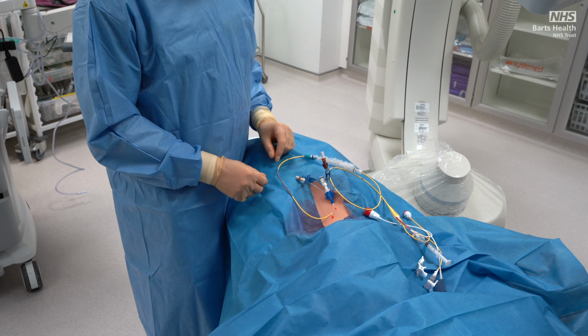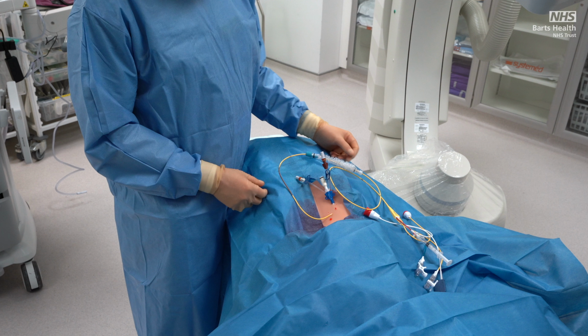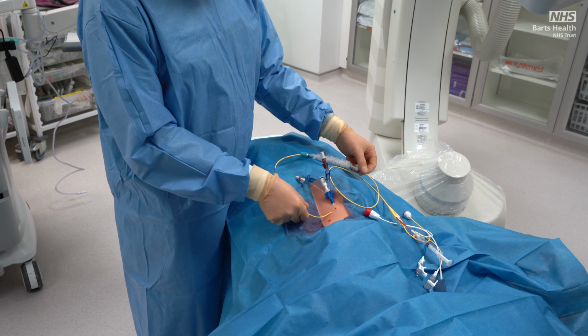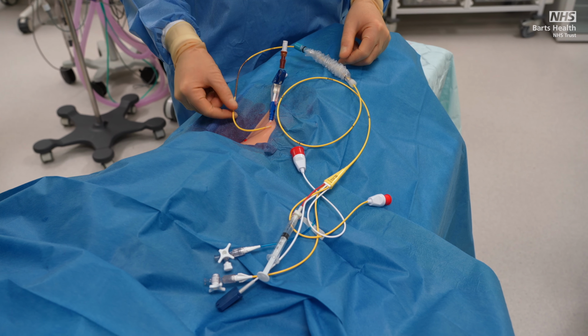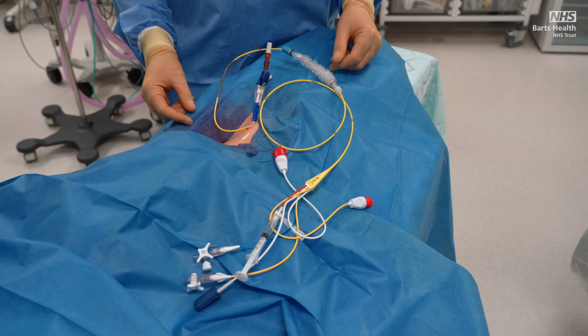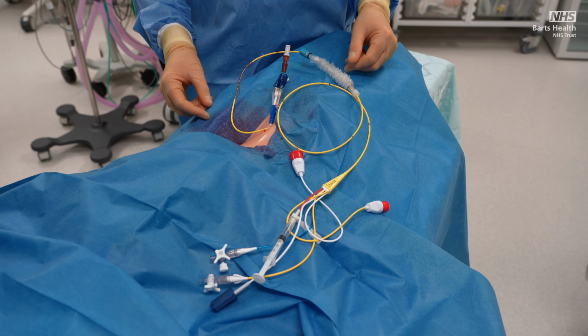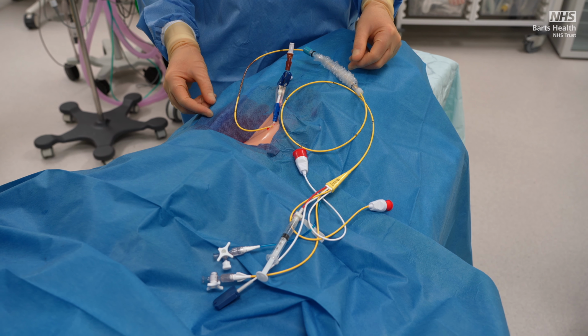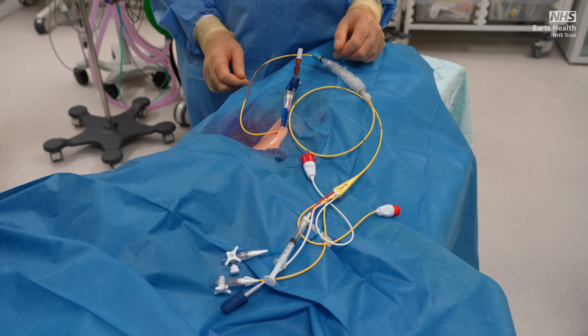Next, lay the catheter out on the patient, ensuring that you maintain the natural curve. Think about the orientation of the J tip, ensuring that you would like it to pass through the tricuspid valve. For that to happen from the right internal jugular, the J tip needs to be inserted into the introducer sheath, pointing towards the patient's left.